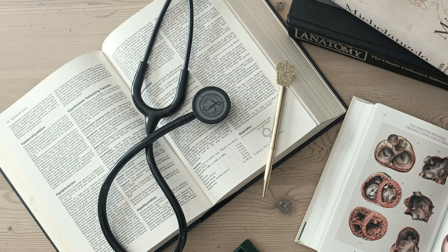This finding should trigger an immediate and high level of alarm for you as a clinician. So starting with ventricular flutter, V-flutter, how does that typically appear on an ECG and what does it mean for the patient? On an ECG, ventricular flutter is characterized by no discernible P waves related to the QRS. You'll see very broad QRS complexes, unequivocally indicating a ventricular origin.